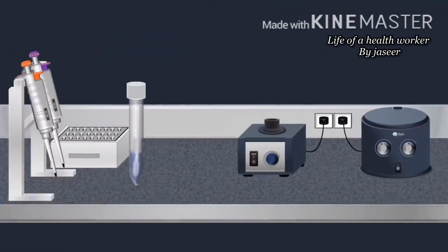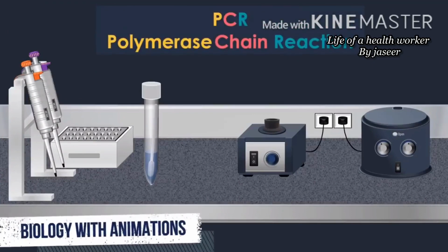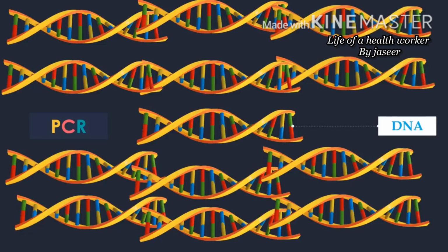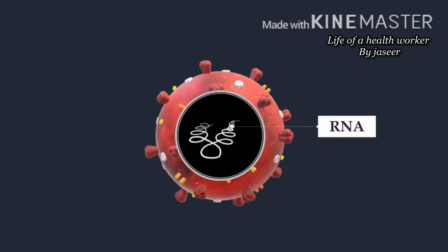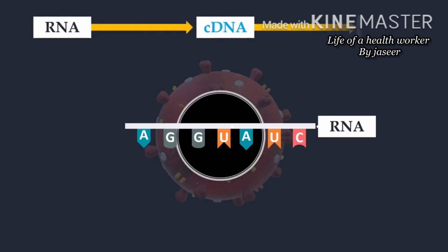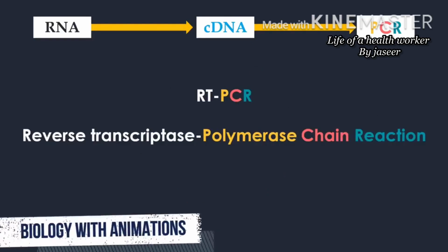The standard method of coronavirus testing is polymerase chain reaction (PCR), a method widely used in molecular biology to make millions to billions of copies of a specific DNA fragment rapidly. Coronaviruses contain an extraordinarily long single-stranded RNA genome. To detect these viruses with PCR, RNA molecules must be converted into their complementary DNA sequences by reverse transcriptase. Then the newly synthesized DNA can be amplified by standard PCR procedures. This approach is universally known as RT-PCR.